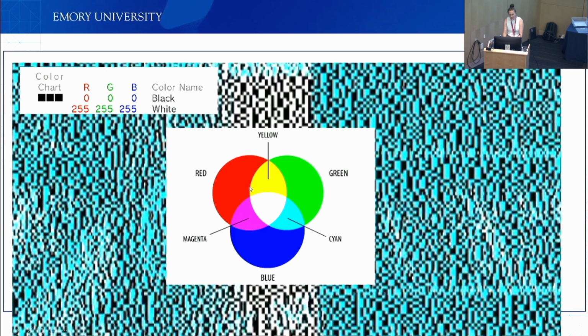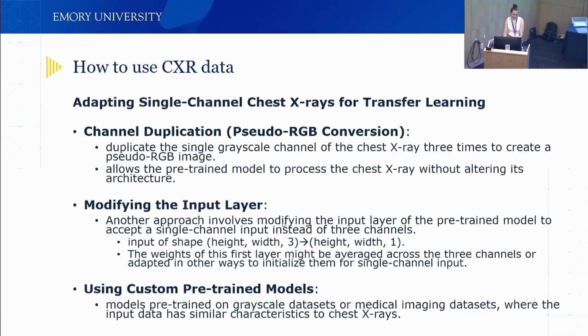Your brain sort of messes with you, and that's something you have to take into account when you go between grayscale and color, is that X-rays and CT data are not in color. There's no color in there. If you represent it in RGB, even though visually it looks like grayscale, there are RGB pixels in there. So this is the overlay, which is from all of these colors.